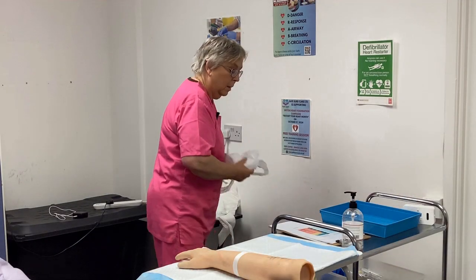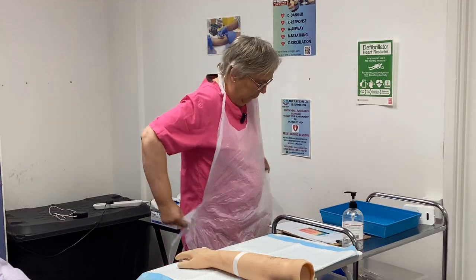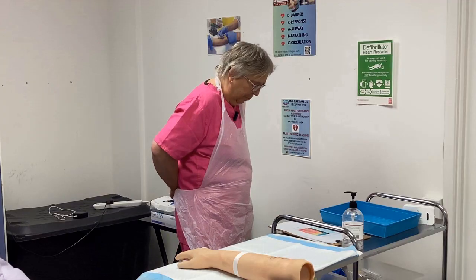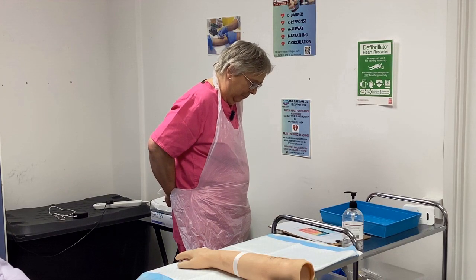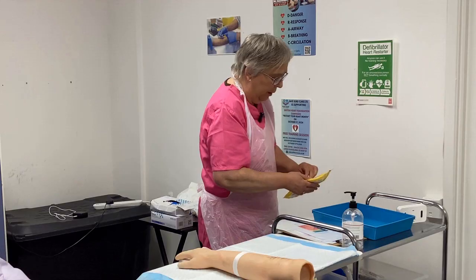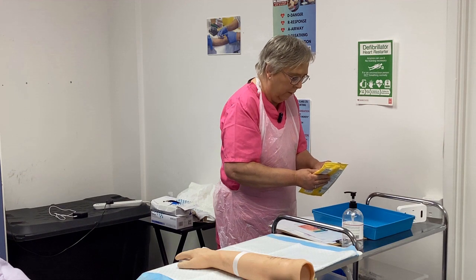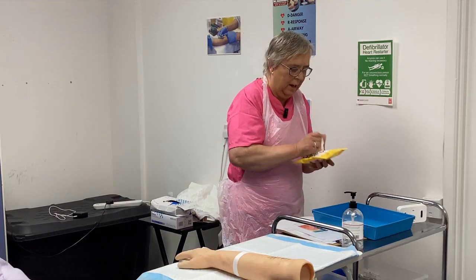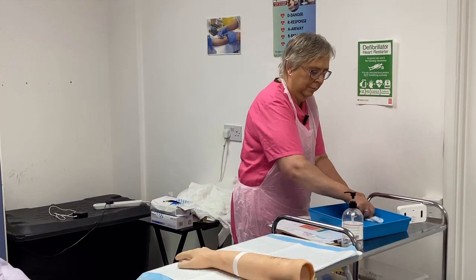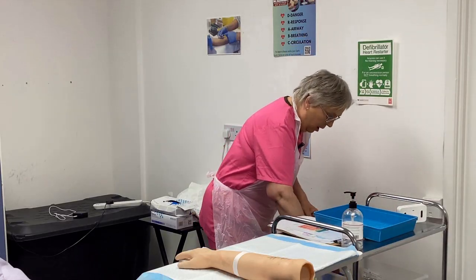Just going to pop my apron on, and I'm just going to get my equipment ready. Just going to get my wipes out. If the hydraulic tray has not been cleaned, I'm going to take my wipes. I'm going to check the date and make sure they're within date. It's 2028. Just going to give my tray a wipe — zigzag across, front, back to front. Get rid of that. Let that dry for 30 seconds.